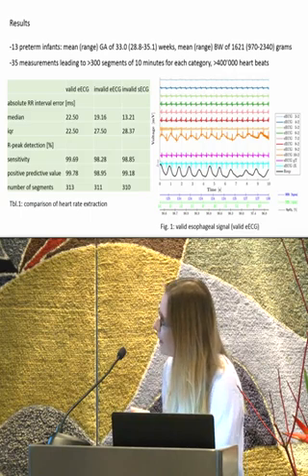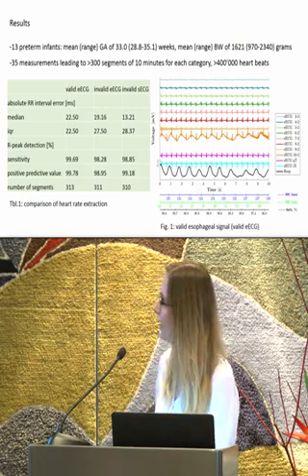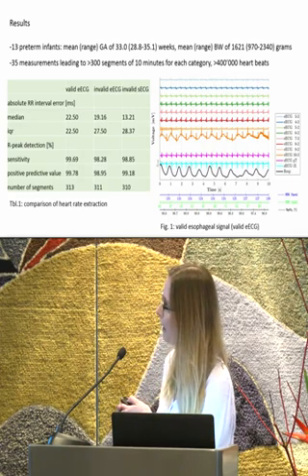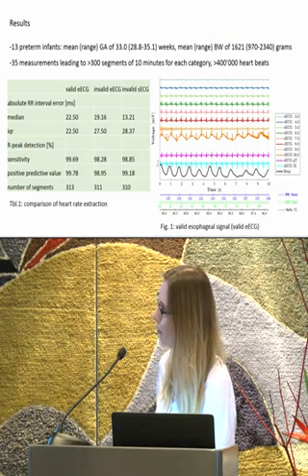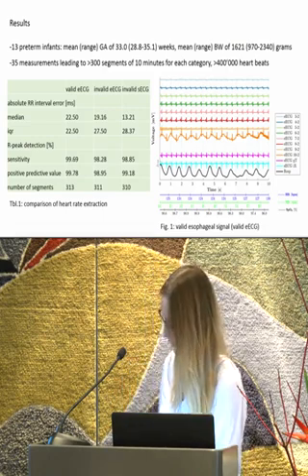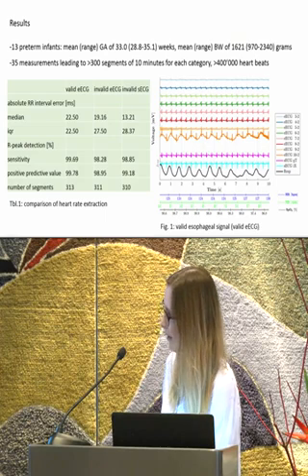On this figure, you now see the signals that we captured. We have the esophageal signals, 8 for 8 electrodes. On the upper part, the most proximal electrode, on the lower part, the most distal electrode. Then we have our reference signal, which was captured by the surface electrodes. And we have the standard monitoring data in the lower part, also with the numerics.